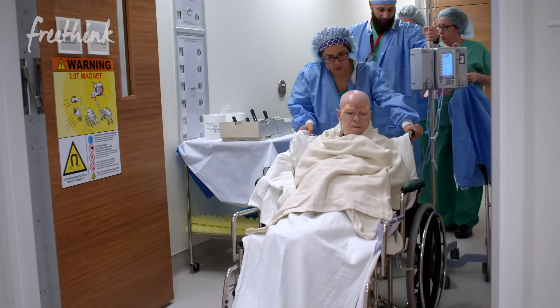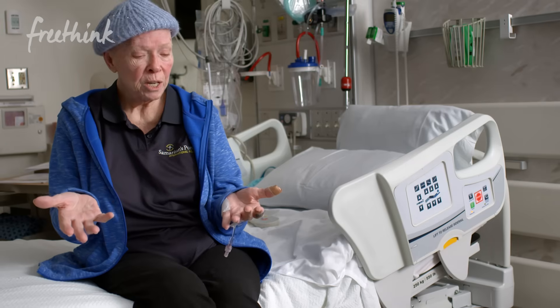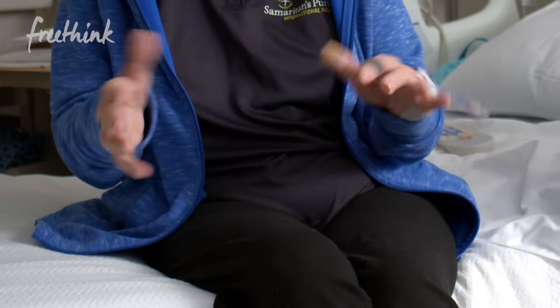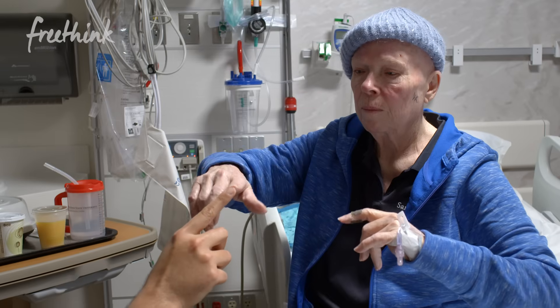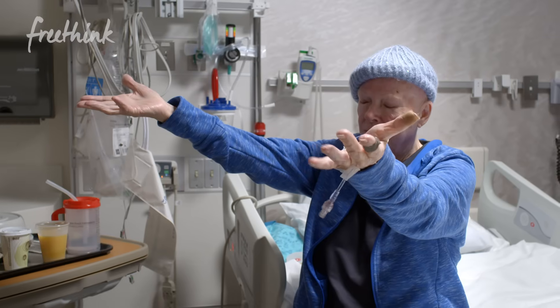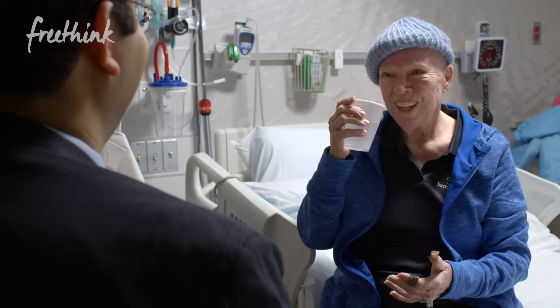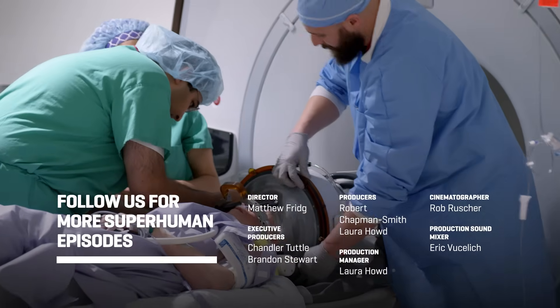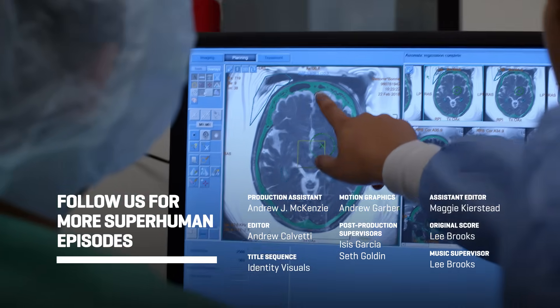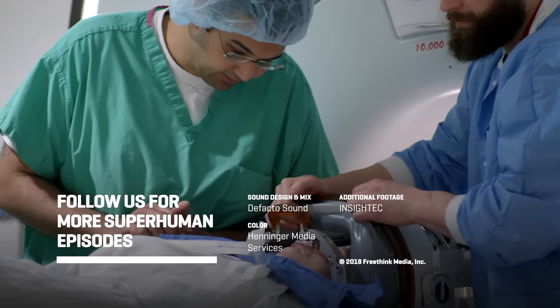We were able to reduce the tremors by 40% during the treatment. Just look at my hands. Had you been here yesterday morning, my right hand would be doing what my left hand is. Bonnie DeTore has been one of the toughest patients who has undergone the focused ultrasound procedure. She's looking forward to the next phase in her life, being able to do things she wasn't able to do before. It's so much more than I could have imagined. I'm starting to come back alive.